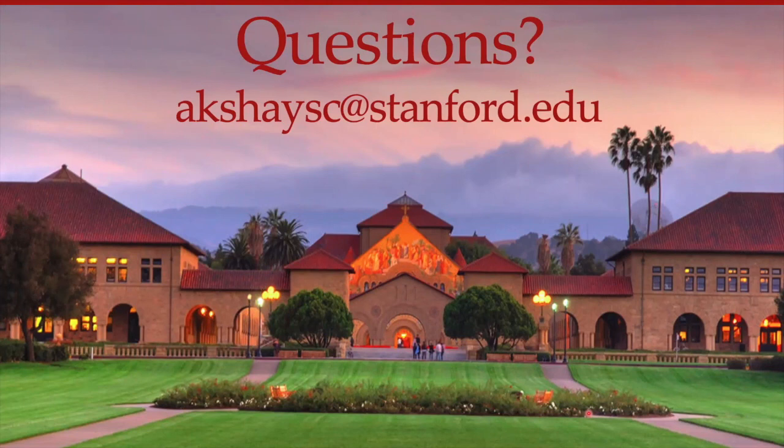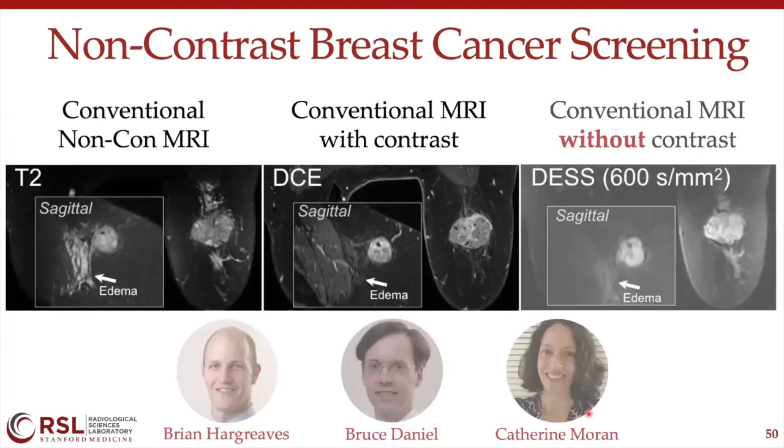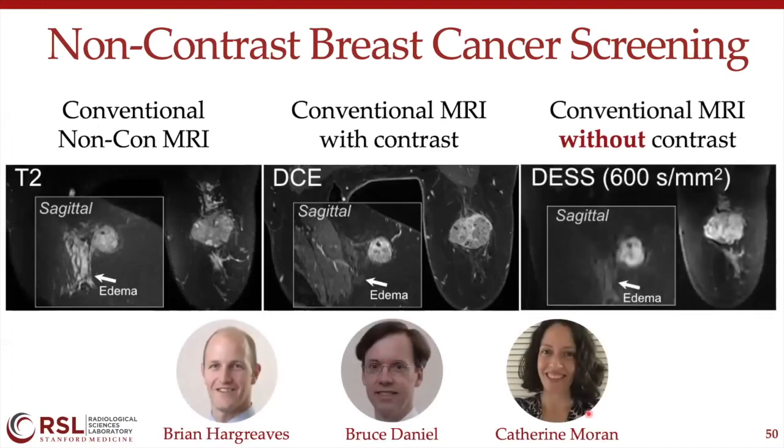And if no one else has a question, a second question: the gadolinium contrast agent is clearly giving very high contrast. And the second image you showed was really very nice. Yeah, this is the one. But compared to the gadolinium image and this one, how different is the contrast quantitatively? I'm asking honestly how clearly we are able to see, because this looks like an advanced tumor. If you want to apply it at a very early stage, how far can we pick up lesions using your method or the deep learning method?